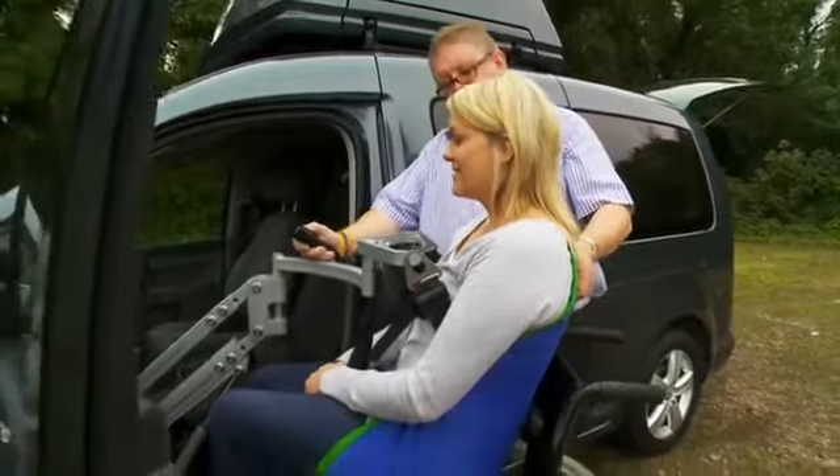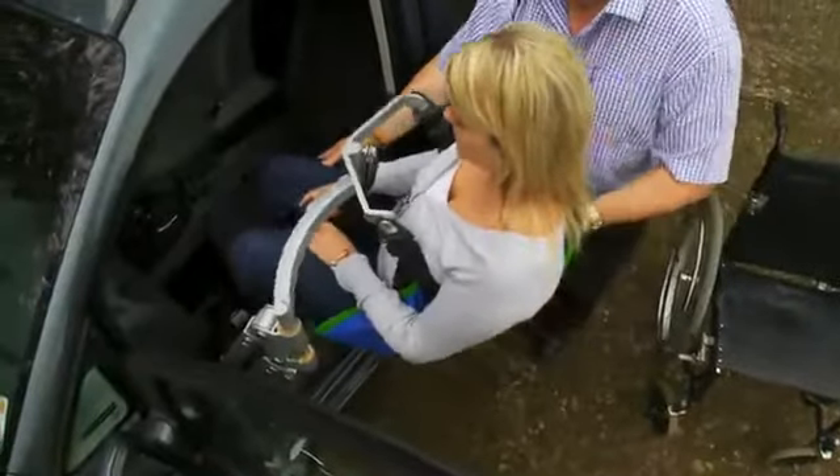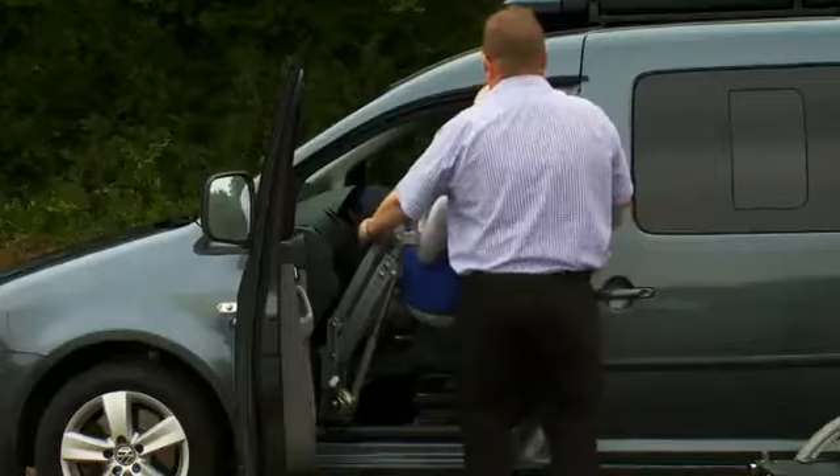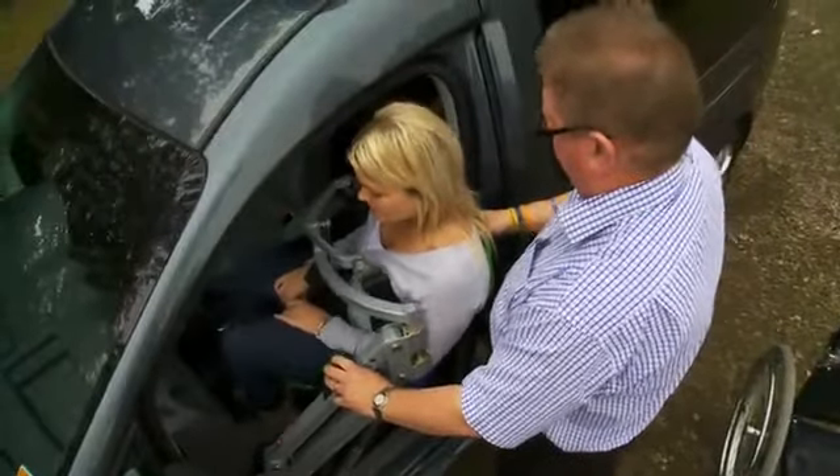For some people this may be an alternative solution to getting a fully converted wheelchair accessible vehicle. However, you'll need to check with an adaptation installer that your car is suitable for this type of hoist.